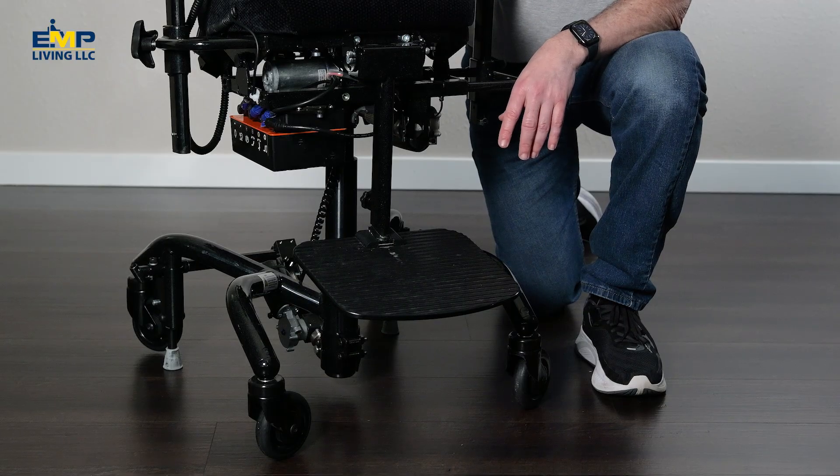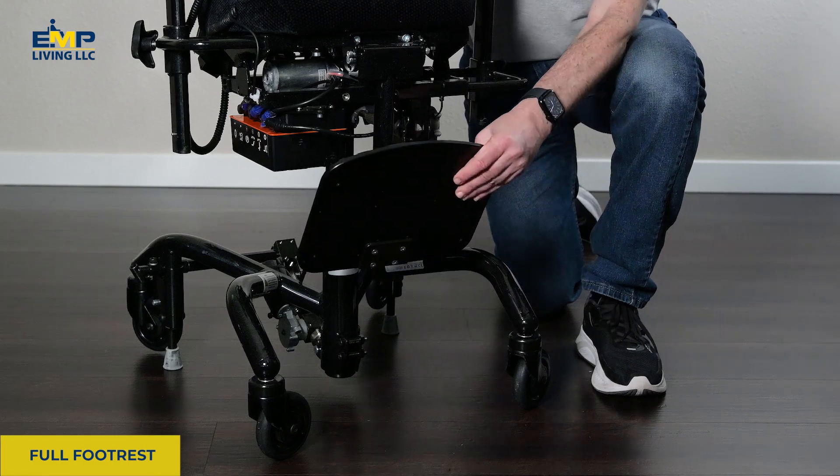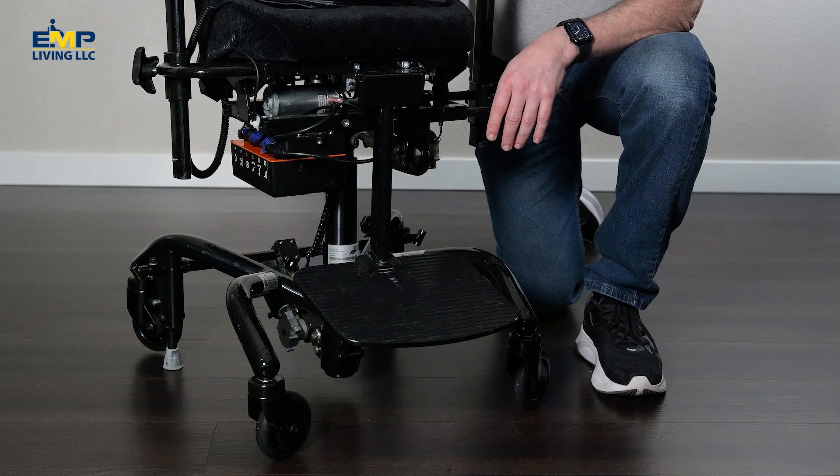This is the full foot ring — it covers both feet. We also make just a left or right version. This is another leg rest we offer: the full foot rest. It's foldable, so the foot plate itself can fold up or down, and it also goes up and down with the seat.